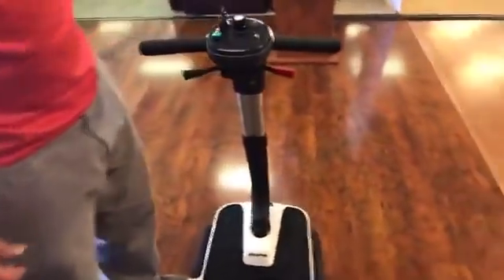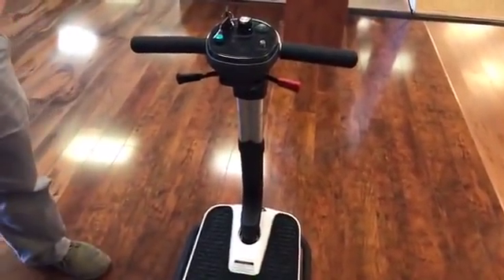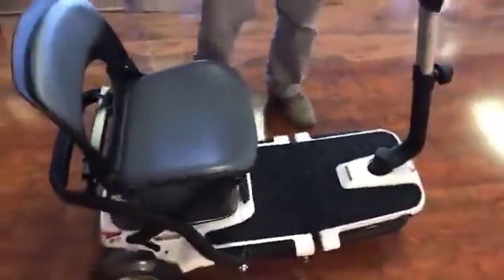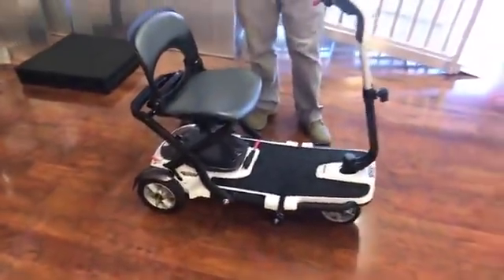One of the nice features about this is you have the ability to do standard batteries and lithium batteries. Lithium batteries will last a lot longer.